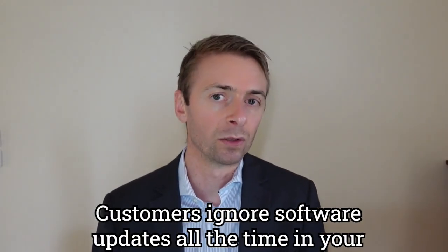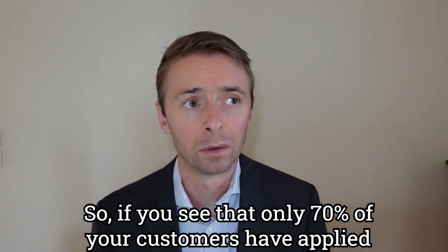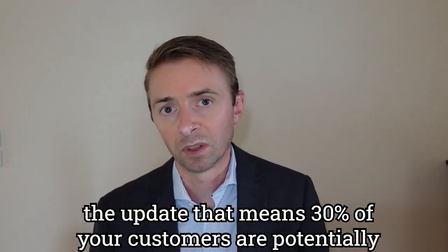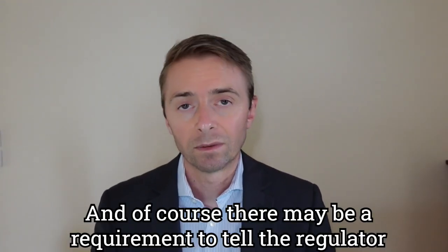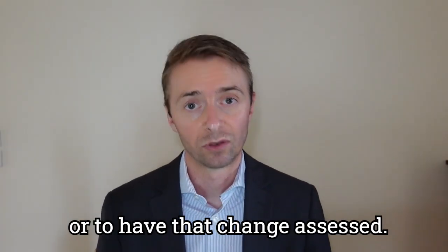Customers ignore software updates all the time. In your case, that could lead to harm. So if you see that only 70% of your customers have applied the update, that means 30% of your customers are potentially still at risk if you've just pushed that update to fix a problem. And of course, there may be a requirement to tell the regulator or to have that change assessed.